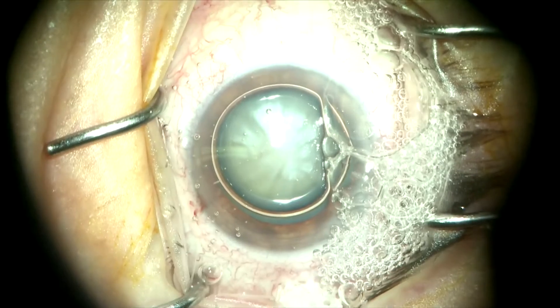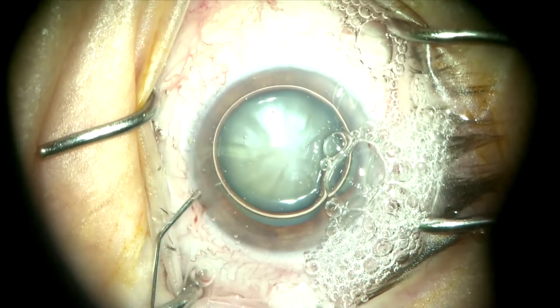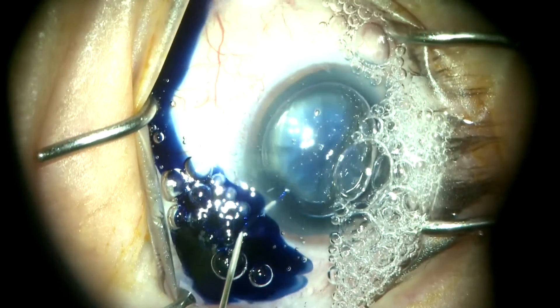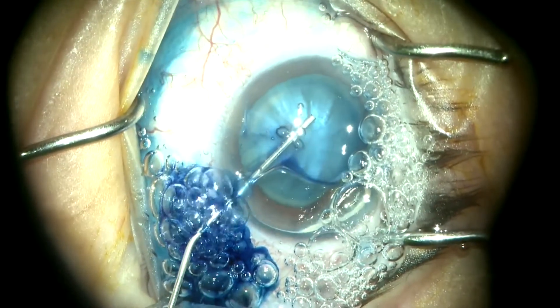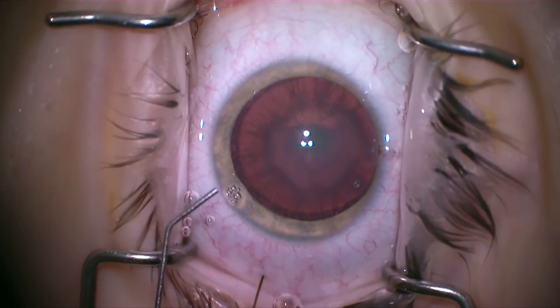Another nice way that people use Tri-Pan Blue is to put it under an air bubble. This helps to concentrate the Tri-Pan Blue on the anterior capsule. Initially we thought Tri-Pan Blue may be a little bit toxic to the endothelium, but we know that's really not the case anymore. You'll then evacuate that air bubble either with a little bit of balanced salt solution, or in this case we're using OVD, and that works well.